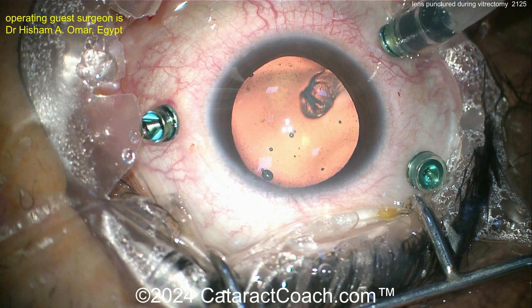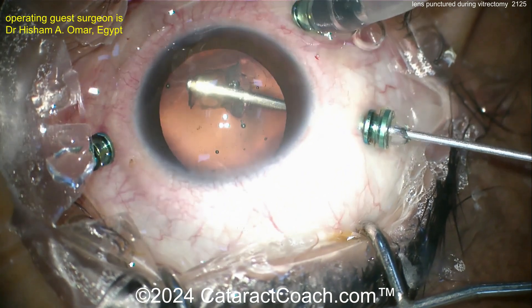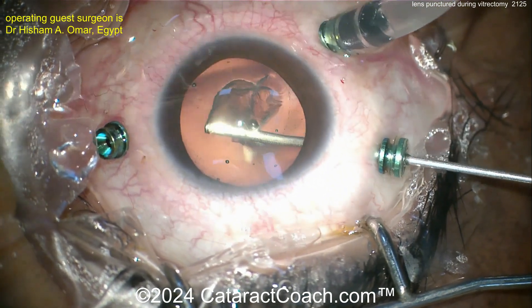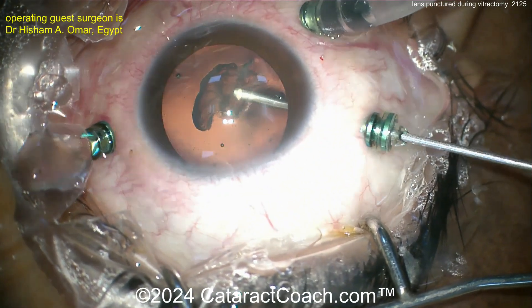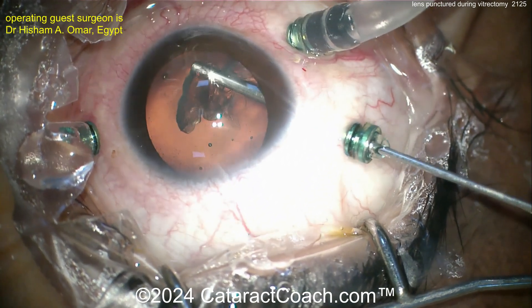The puncture may be at the lens equator. The first step is doing another pars plana vitrectomy — three ports — using the vitrector to remove the lens. Going in from the back surface, through the posterior capsule, and removing the lens material completely in this manner.